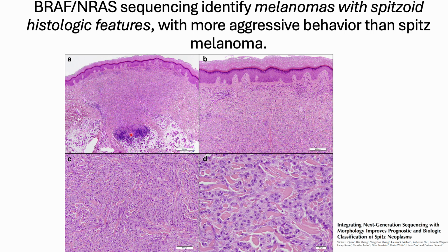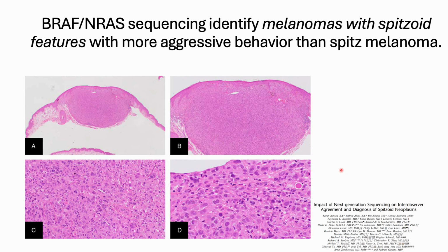You can see it's quite a small wedge-shaped tumour. It has a diffuse proliferation of melanocytes which are quite epithelioid. They do have a little bit bigger nucleoli than you regularly get in an atypical Spitz tumour, but this tumour turned out to have a BRAF mutation and a TERT promoter mutation and a bunch of other melanoma progression markers, so it would be more accurately classified as a melanoma with spitzoid features. And here's another example.